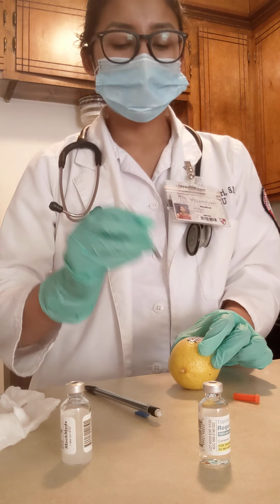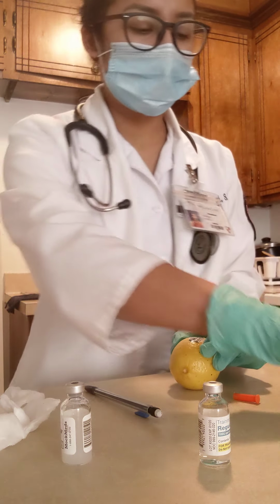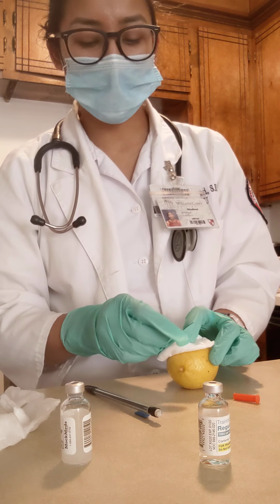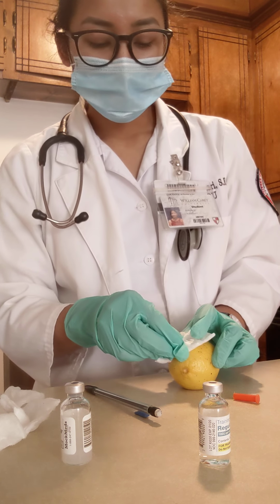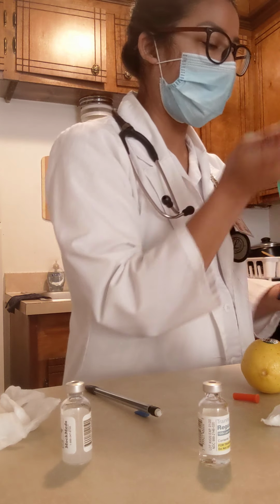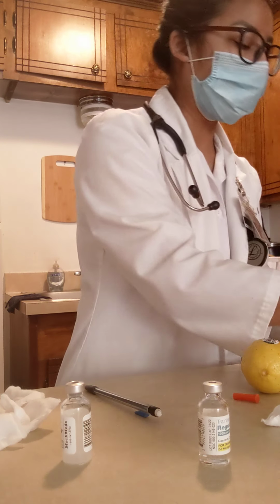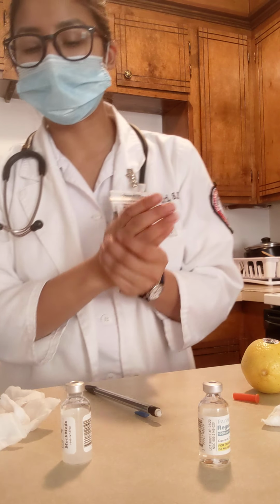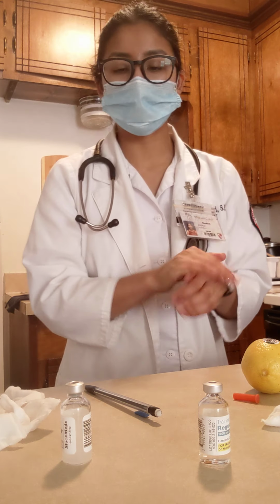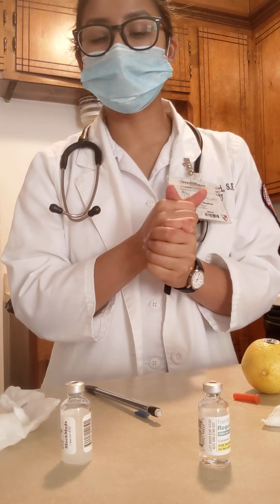Now I will discard this syringe in a biohazard bin without capping it, and I'll place another alcohol swab on the site for a few seconds. Now I will remove my gloves, do hand hygiene, and document the medication that I gave, the route, the time, the dose that I gave, and how the patient responded to the procedure and to the insulin.